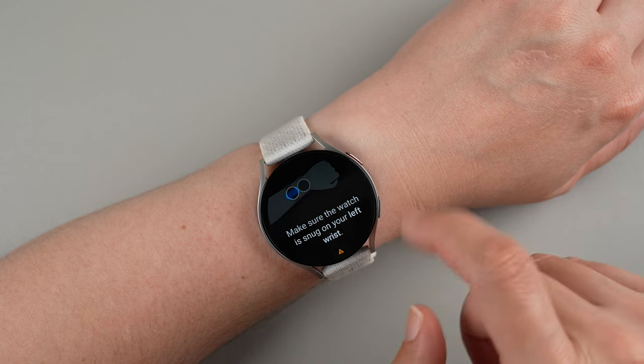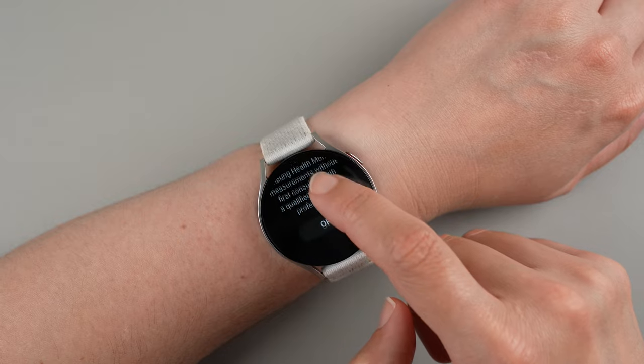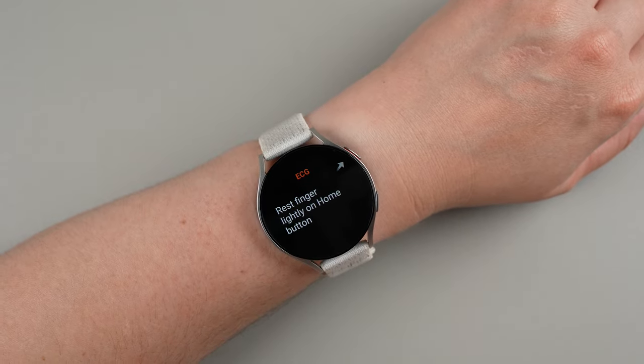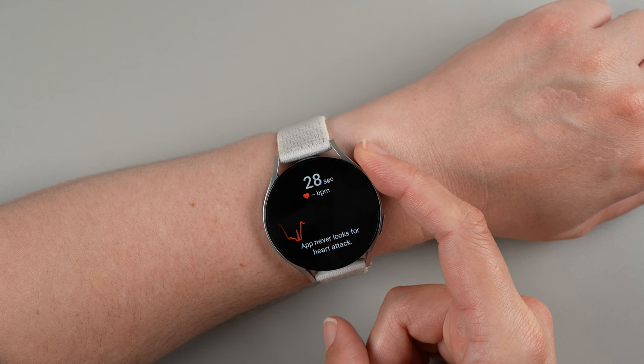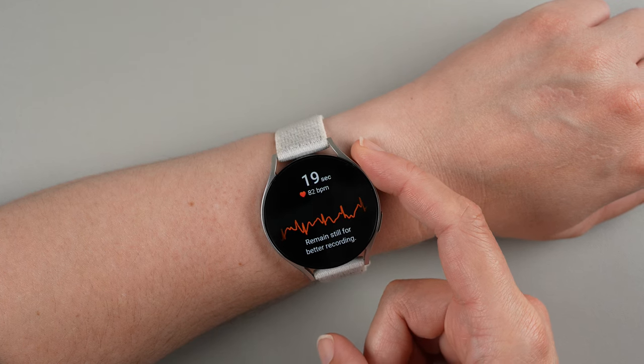It says make sure the watch is snug on your left wrist, then rest your finger lightly on the home button. Now we're going to see a countdown here. I'm not sure if it's going to be okay with me talking while I do this, so maybe I will be quiet.